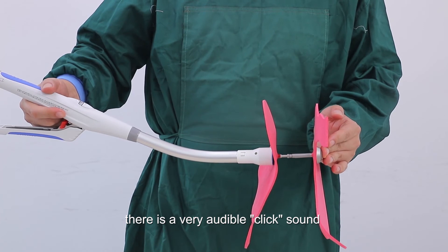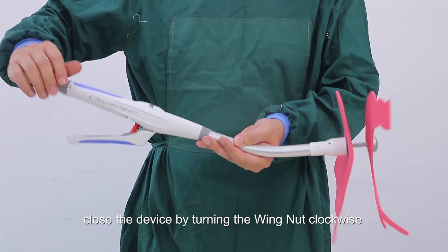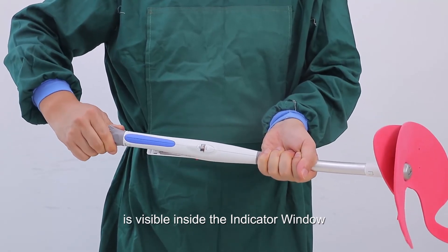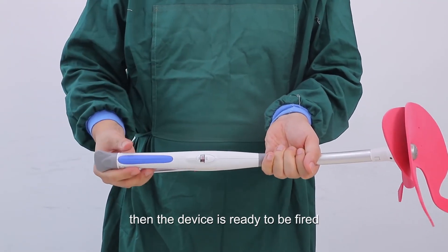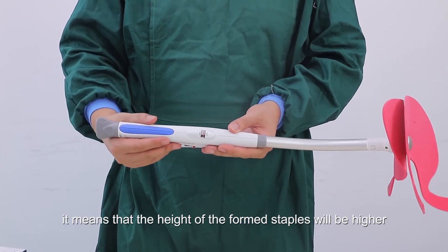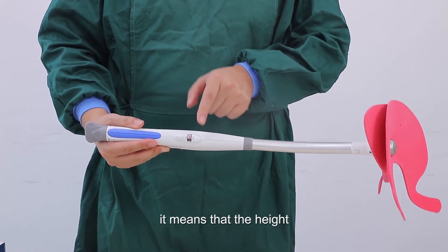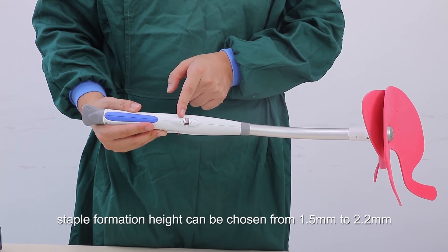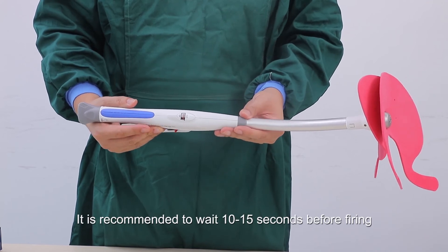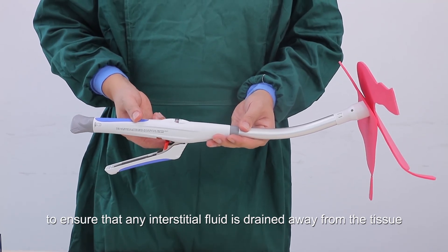An audible click confirms that both sides are fully and properly connected. Close the device by turning the wing nut clockwise to bring both tissue sides together until the staple height indicator is visible inside the indicator window — then the device is ready to fire. When the indicator is closer to the top of the window, the staple formation height will be higher. Staple formation height can be selected from 1.5mm to 2.2mm.